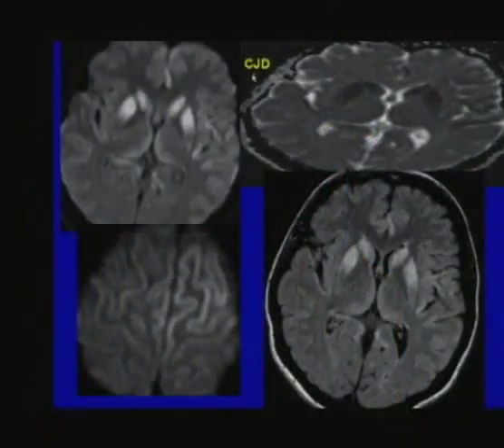We'll go from structural degenerative changes to an inflammatory process known as CJD. The characteristic features in Jakob-Creutzfeldt or Creutzfeldt-Jakob disease, as the name has been rearranged in recent times, show vacuolization and characteristic changes in the basal ganglia and in the cortex. And this is a rapidly dementing disorder. You have somebody who may be at any age who over several weeks or months shows a very rapid progression. These are the findings that you're likely to see.